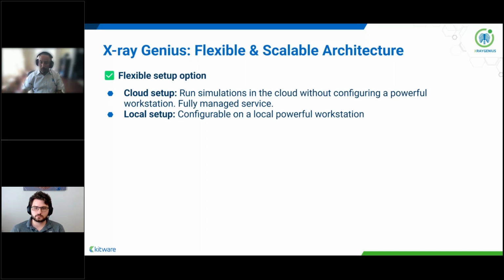The first part is deployment. X-Ray Genius can be deployed on the public cloud, on a private cloud on premise, or even in a local setup on a powerful local workstation. If you have a cloud setup, you can run your simulation on the cloud without the need for high-end hardware.